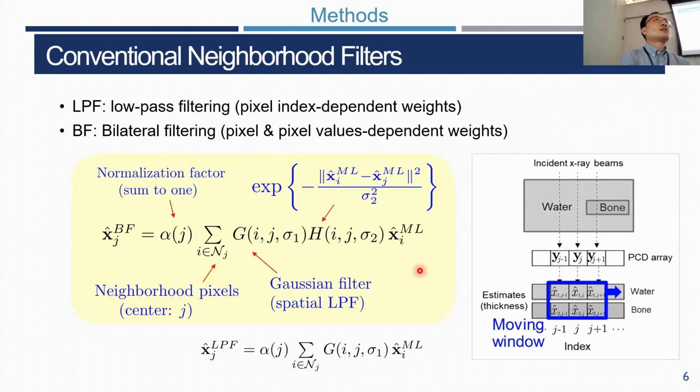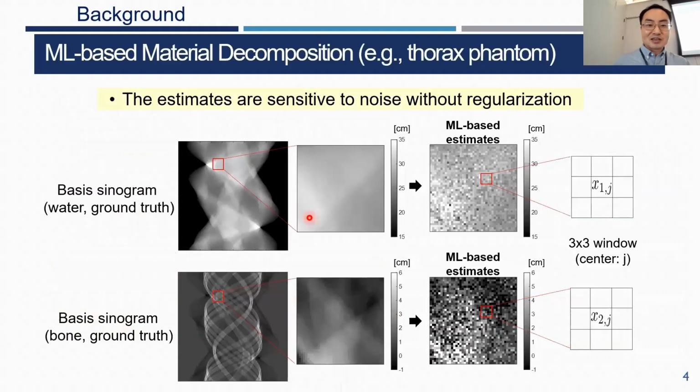That could be possible. I saw some studies applying non-local means in the energy-wise projection domain, and maybe a classical bilateral filter may work there because they are much less noisy than this one.